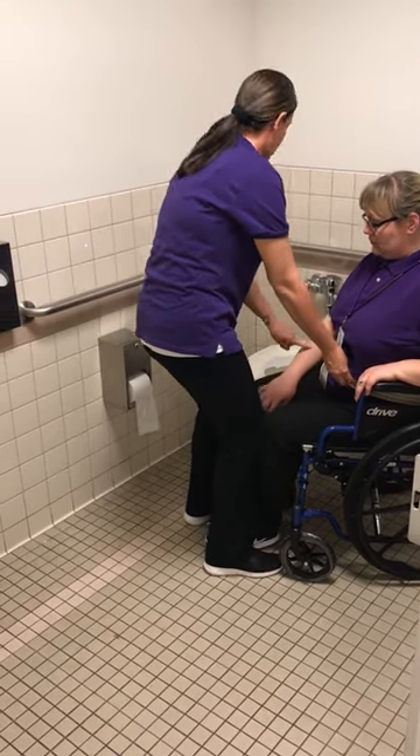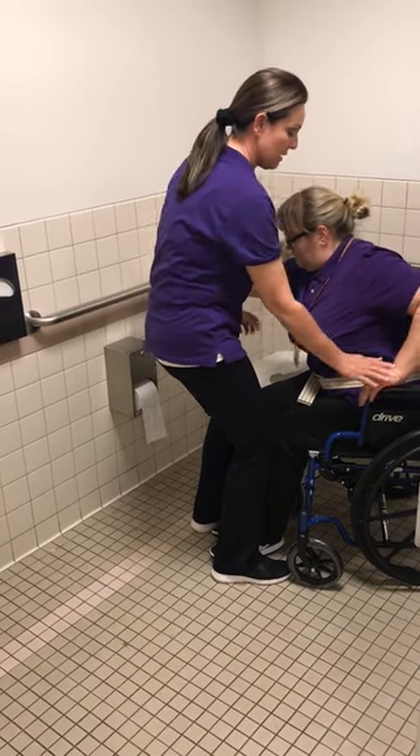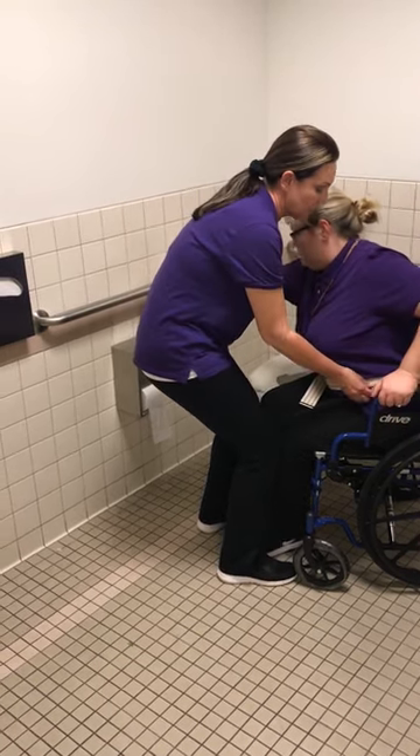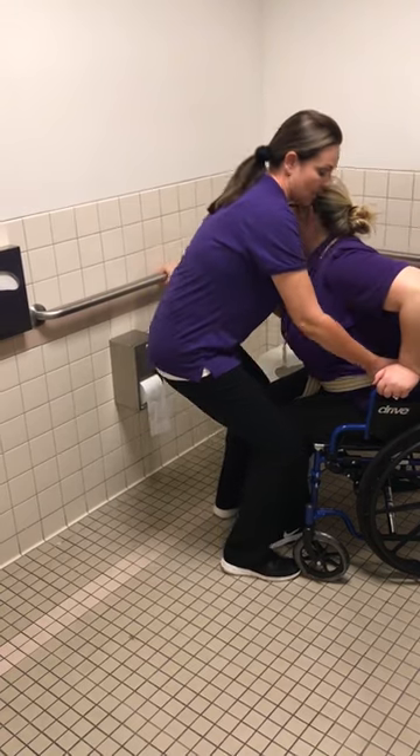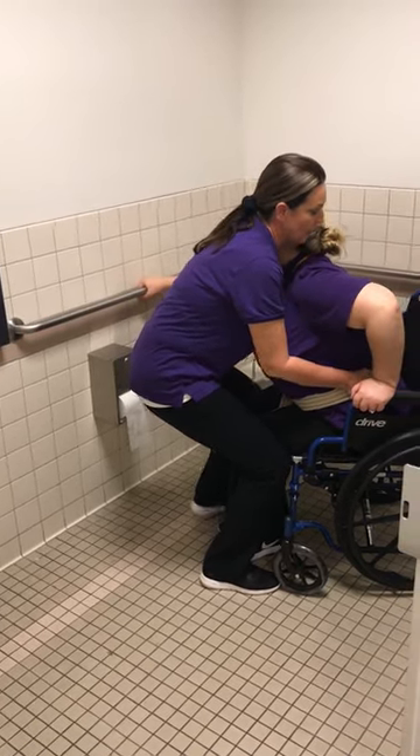Go ahead with your right arm and reach out to the grab bar and hold onto that. Your left arm is secure. Are you ready? All right — one, two, three. Up.